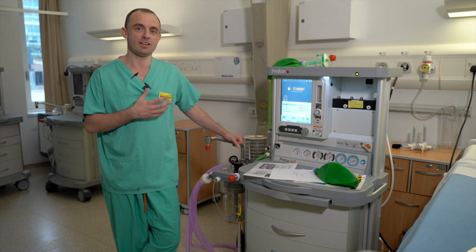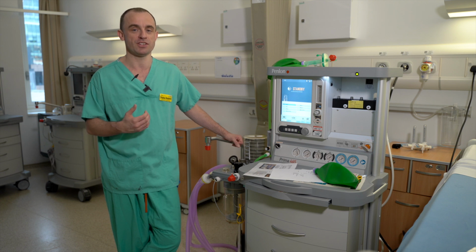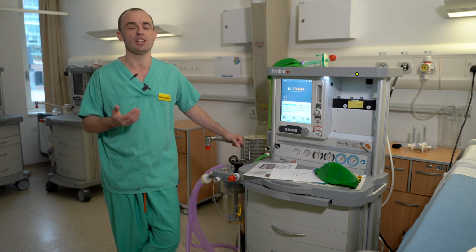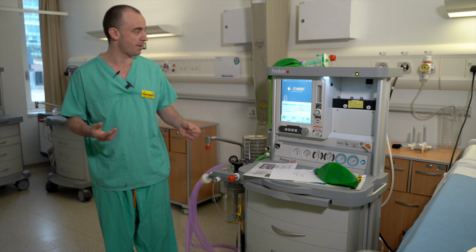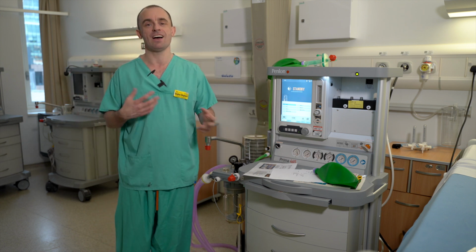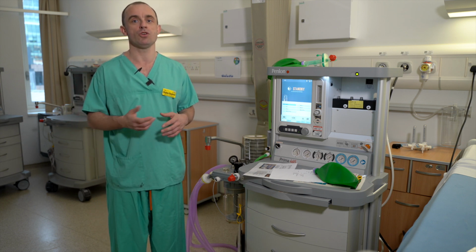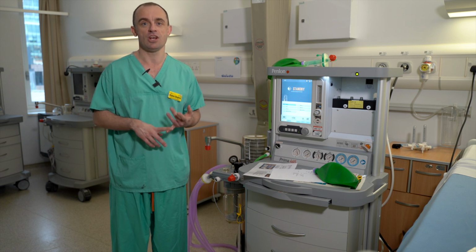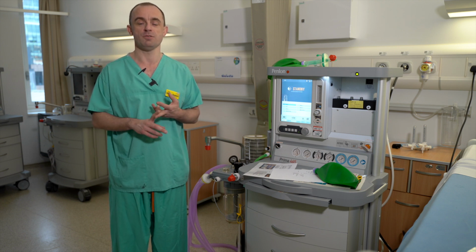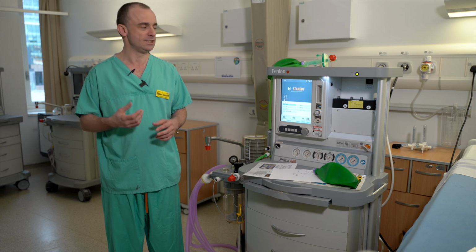An anaesthetic machine, and these machines are different, will continue to ventilate even if a patient is trying to breathe, unless you've put it in a mode like SIMV where you are facilitating that. But these top three modes are entirely mandatory ventilated. So if a patient tries to breathe, what you'll see are signs of the patient fighting the ventilator. So you'll see high peak pressures, you'll see low tidal volumes, and you may see tachycardia or hypotension, depending upon the physiology. But we'll talk through each of those in time.